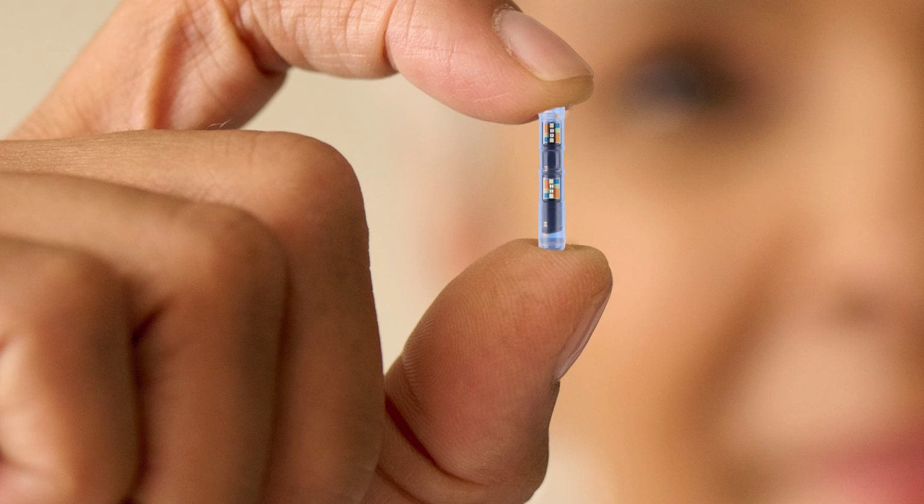Sure. So the placement, you're right, is exactly the same. We're in about the same depth beneath the skin. So it is in the interstitial fluid, right? The fatty tissue is where it sits. We all get our glucose from the same place. The technology is different because all of the other technologies, or most of the other technologies, certainly the most common ones, are all an enzyme. They chew up glucose and they give off electrons, right? And that's the same whether you're talking about a transcutaneous CGM or frankly the strips and meters that you measure the finger stick testing with.